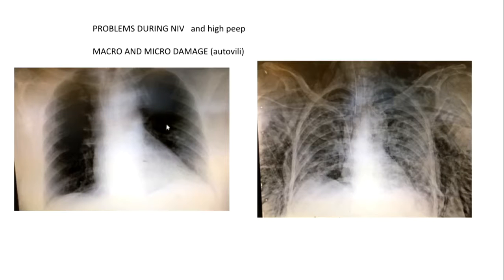This is your next slide, and I think you're going to show us something which is really a problem in the intensive care setting. We are using a lot of devices to improve oxygenation in spontaneous breathing in these patients, above all non-invasive ventilation with mask or other devices.